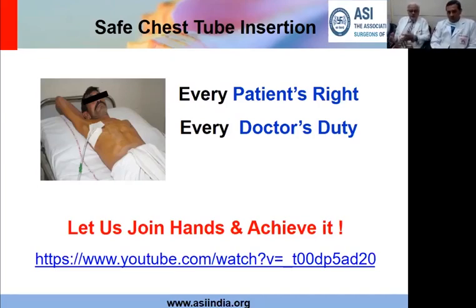You initially evaluated that there is free fluid, and you put in a tube the way you have described. And then at the end, you find that the free fluid has drained, but there is some pocket somewhere. So in this situation, when would you take a call about doing another aspiration, or would you be okay with doing a thoracocentesis for that? What will be your approach to such a situation where there is a residual collection?